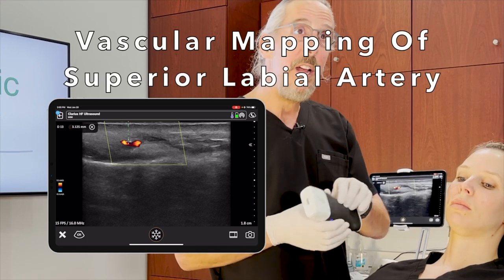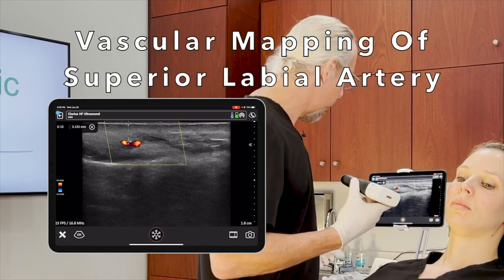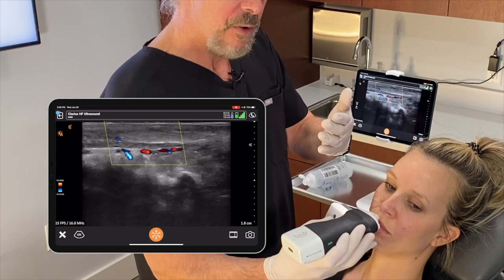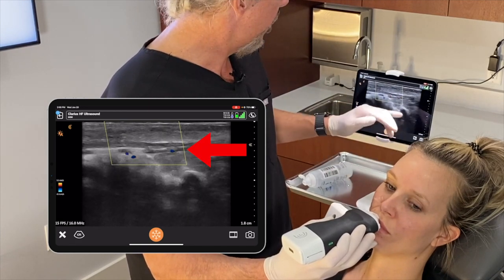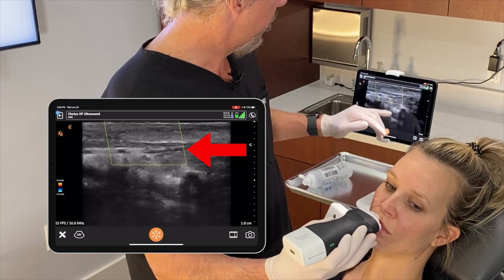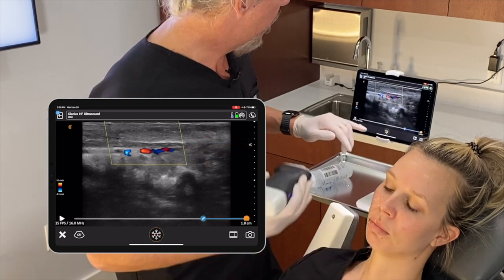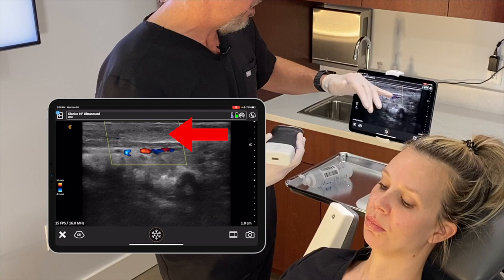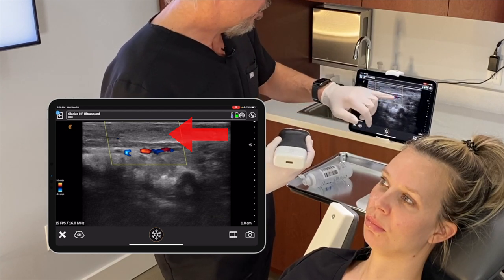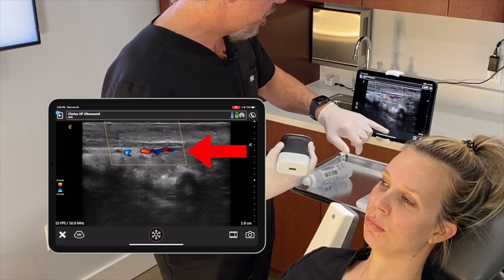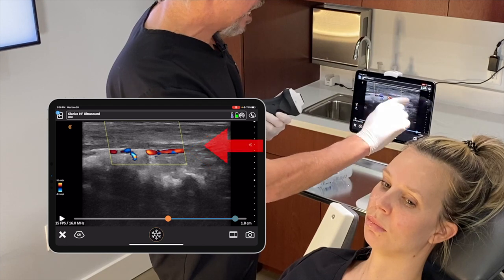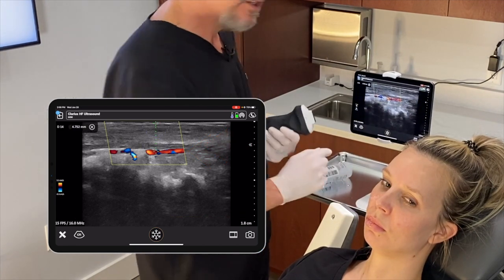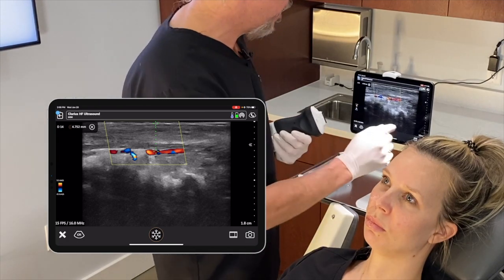Now let's go a little bit inferior and look at the superior labial artery. It's usually deep to the orbicularis oris muscle, as you can see in this visualization right here. You want to put your injection superficial to the orbicularis oris muscle. Here's the artery, and just superficial to that, the hypoechoic area, is the orbicularis oris muscle. In this patient it's 4.7 millimeters deep.